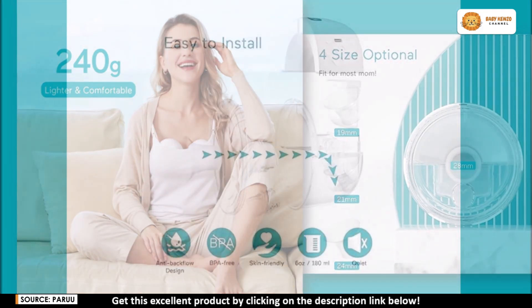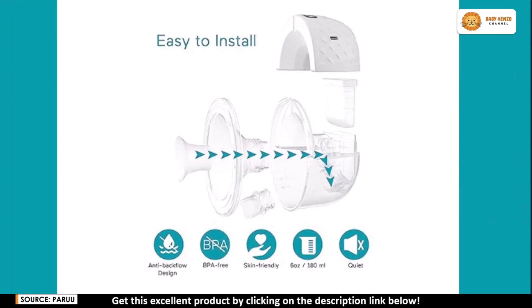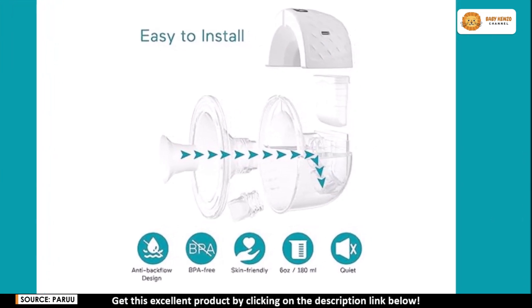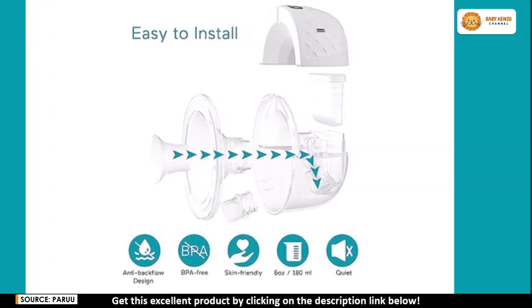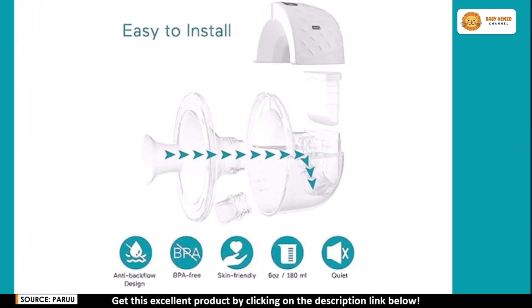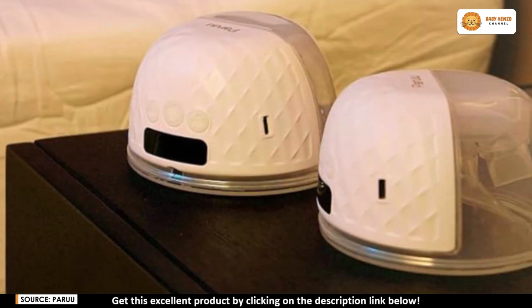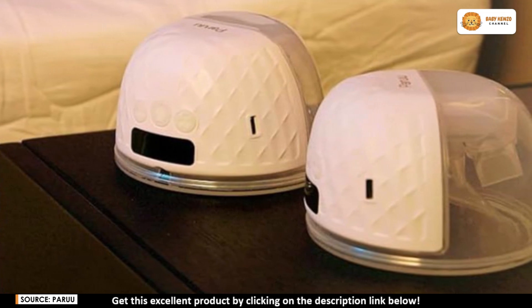Safety is a priority — the Peru P10 is made from BPA-free, food-grade silicone, ensuring that both mom and baby are safe. Its anti-backflow design prevents any milk from leaking back into the pump, keeping the process hygienic and the milk fresher for longer.